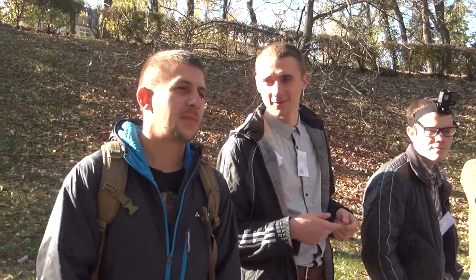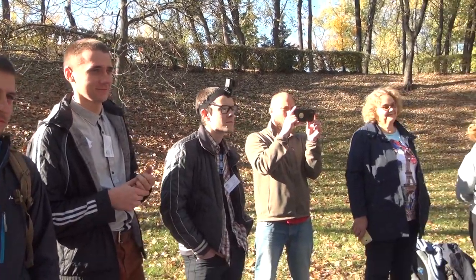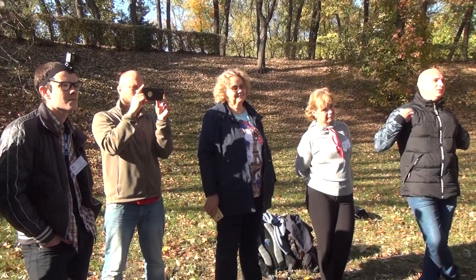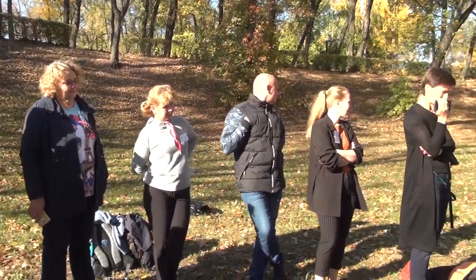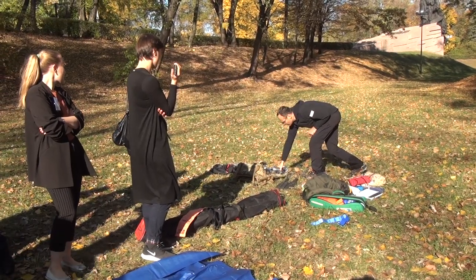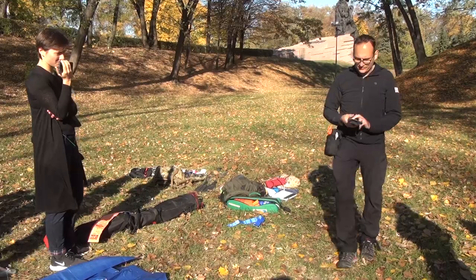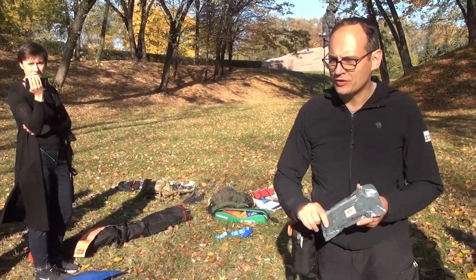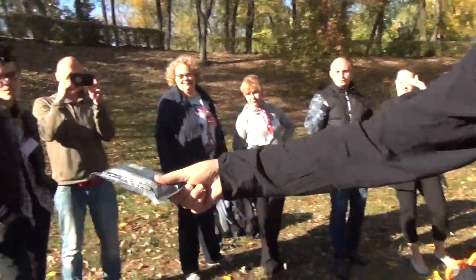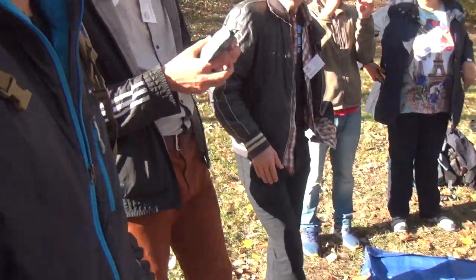Well, pack the wound. Yes, with something. What you said is you can put a bandage around it or pack the wound, and that's the best. Yes. And nowadays, the best thing to do for packing the wound are the hemostatic gauzes. They have some proteins of shrimp or something in it. And you just pass it around.